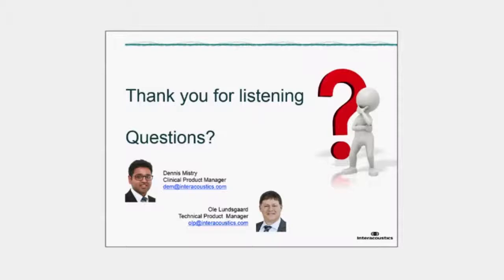Thank you very much, Dennis. As Dennis said, it's open for questions now, so please do not hesitate to write them in the instant message box on the left side of your screen. And Dennis and Ola are willing to answer any questions you might have. While people might be thinking about any questions they might have, I would like to ask Dennis and Ola if they have any common questions they would like to stress now.